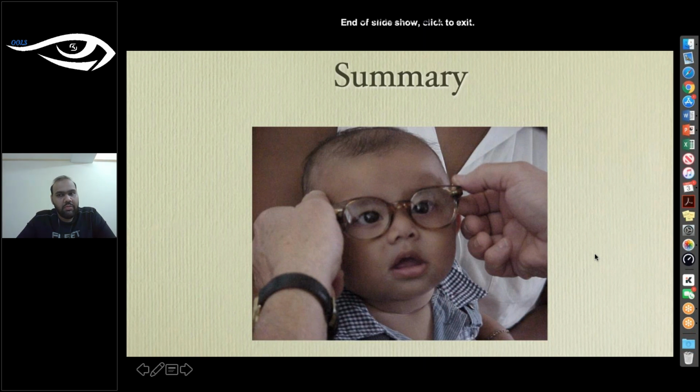They actually devised a technique of doing visual fields using white stimuli, and in fact other kinds of stimuli, attached to this wand that would be presented to the child with the examiner standing behind the child and presenting the stimulus towards the front of the child in all the various positions of gaze.